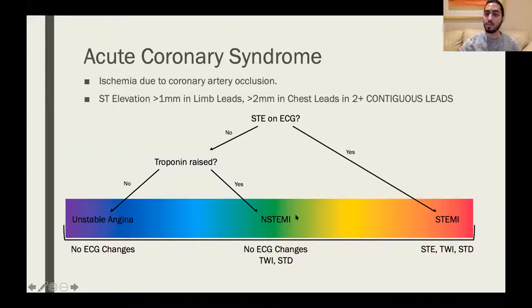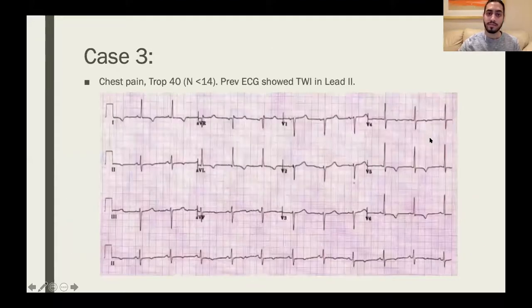And with an NSTEMI, it's worth noting, you may see quite a bit of ischemic changes. Okay. So you could see some T wave inversion or ST depression, but you won't see any ST elevation. And that's why it's called a non-ST elevation myocardial infarction. I hope that makes sense. Let's move on to this case and see what you've picked up.